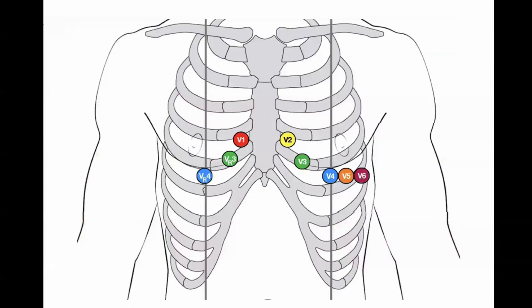In young children, the right ventricle normally extends to the right side of the sternum. To appropriately display right ventricular potentials, ECGs for children in the under 5-year age group must include additional leads, such as V3R and V4R, that are placed on the right side of the chest at the point analogous to the left-sided V3 and V4.